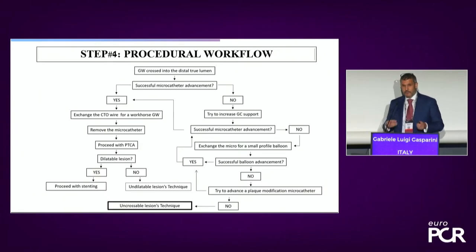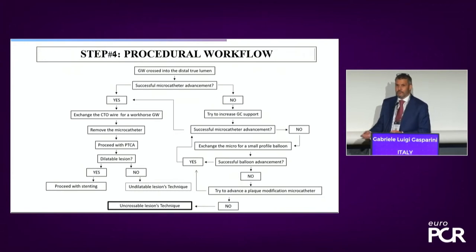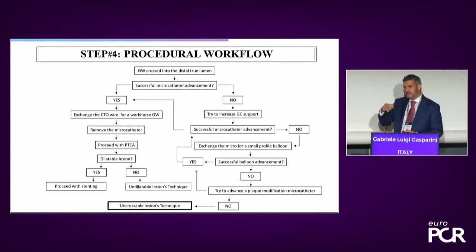The last step is the procedural workflow. I mean, if we are dealing with a calcified CTO, maybe we can have some procedural challenge over time during the procedure. So we should always think to the next step in order to find a solution to overcome some procedural challenge that can occur during an attempt to cross a calcified lesion.